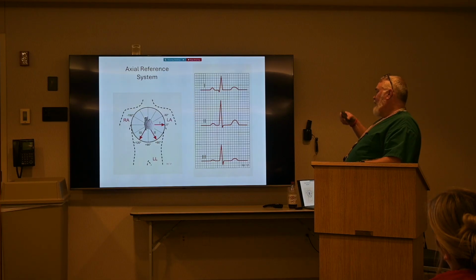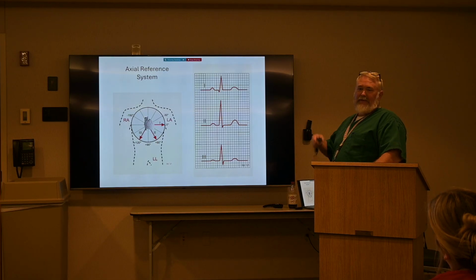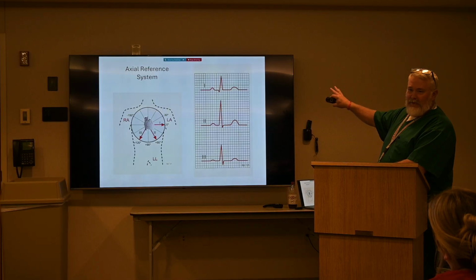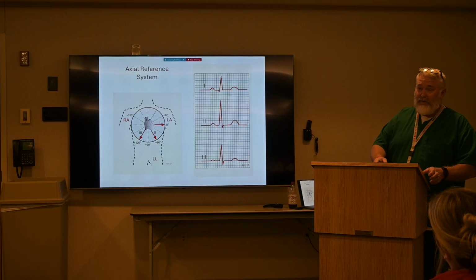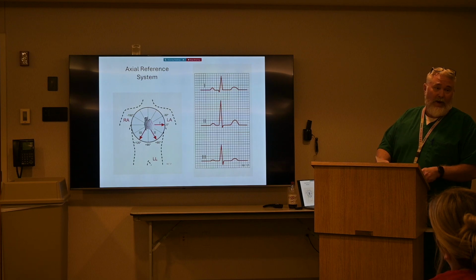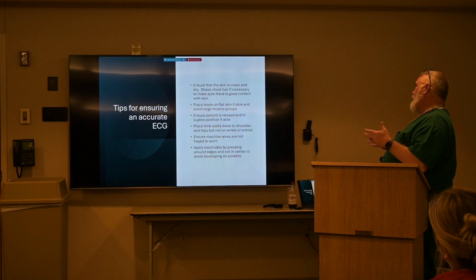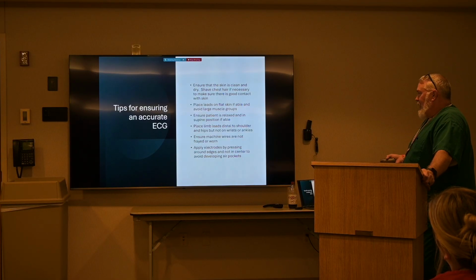As we go along down the road, if we do more advanced classes, we'll get more into the whole axis reference system. But I just want to throw it out there so you understand that this system does exist, and cardiology uses it a lot in determining problems and issues patients might be having. So this is just a quick slide for tips for ensuring an accurate ECG.